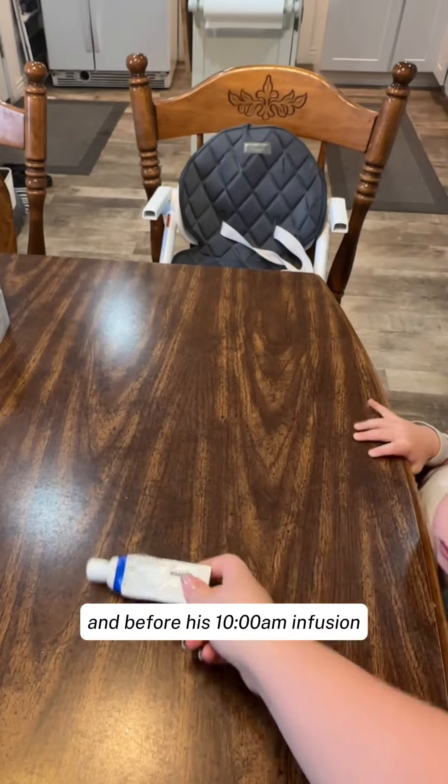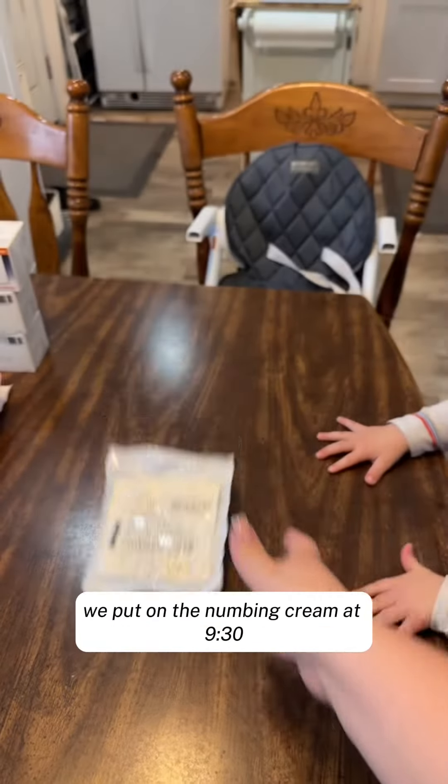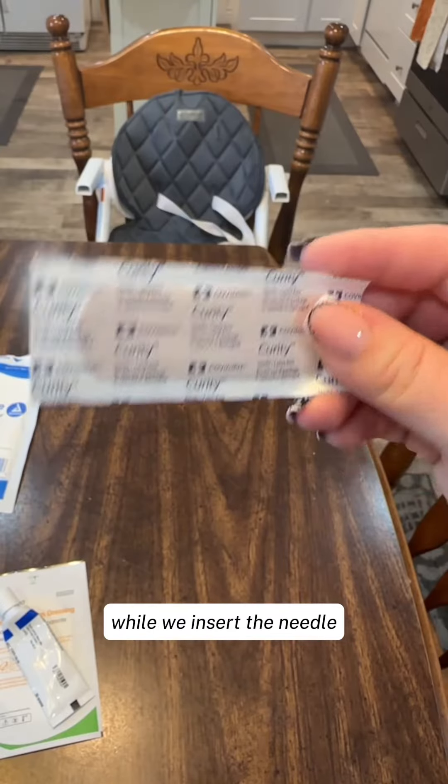My son has a port implant, and before his 10 a.m. infusion, we put on the numbing cream at 9:30. I put the numbing cream on and the Tegaderm, and it works really well to ensure that he feels no pain while we insert the needle.